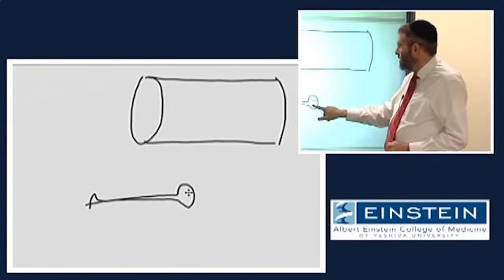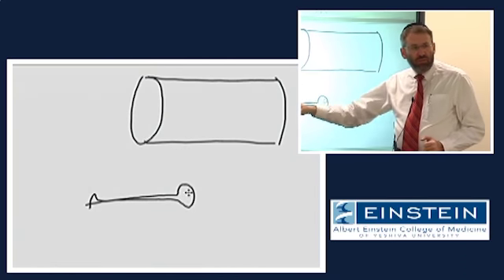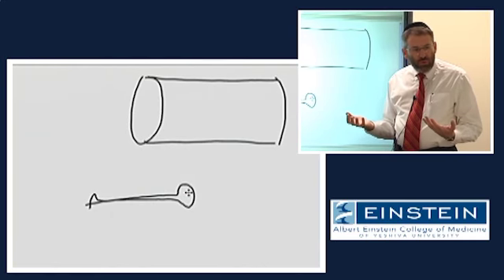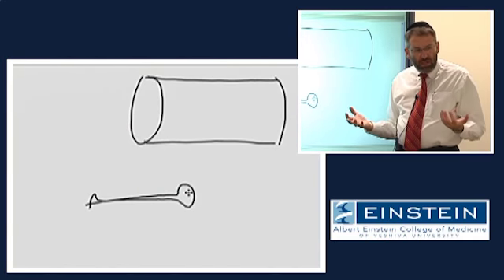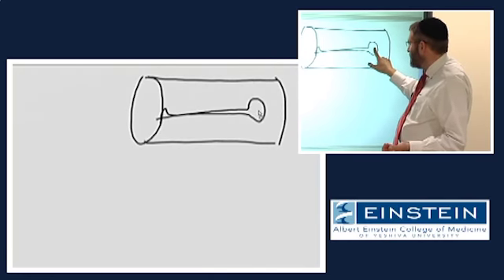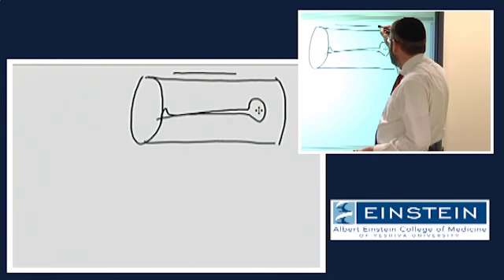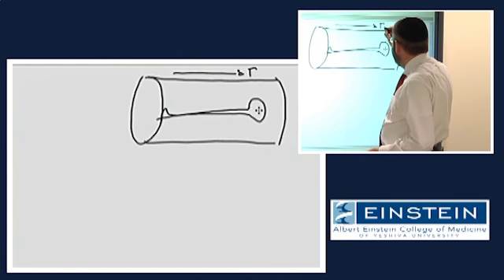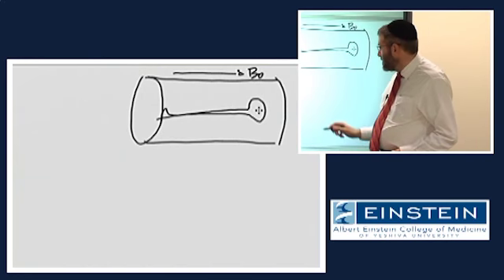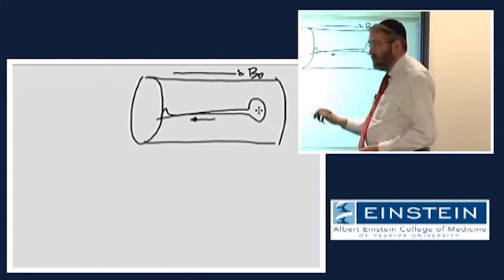When he was out here, all of the protons and all of the water throughout his tissue each had some unit of nuclear magnetism, and they were all randomly oriented. We place the patient in the scanner, under the influence of some strong externally applied magnetic field, and the magnetization of our patient looks like that.